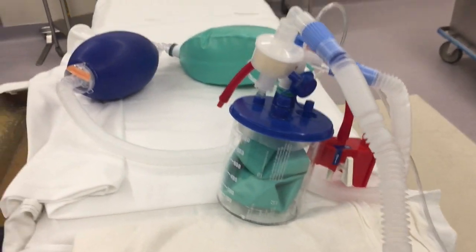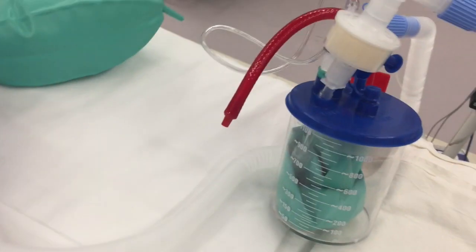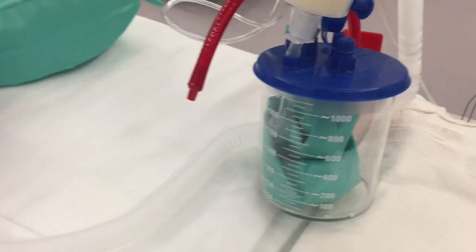So this is the circuit that we just put together. This was originally designed by Dr. Joseph Fisher at the University of Toronto many years ago with Durant Sommer. Alex Vesely and I just spent some time putting this together.